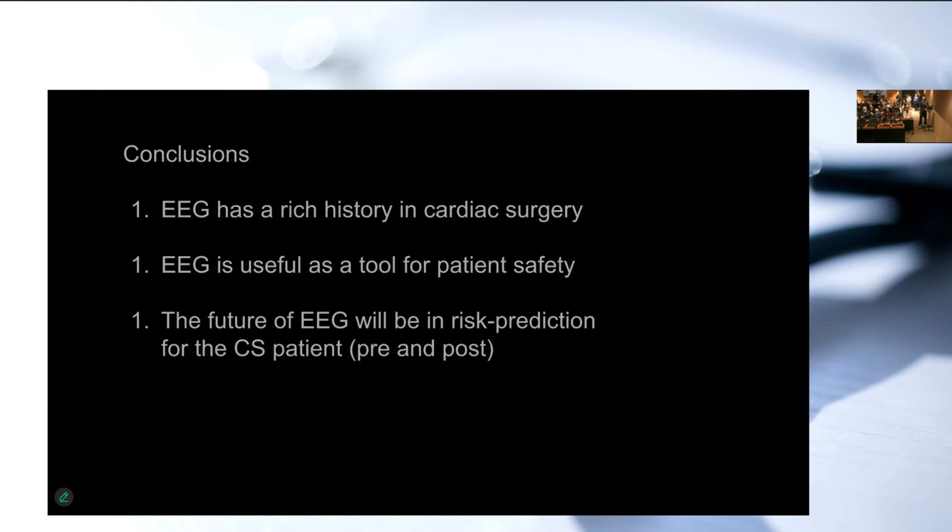And do you think that burst suppression, either as a Boolean operator on or off, is another signal that maybe in the future could help the average anesthetist recognize when anesthesia is excessively deep, as the marker maybe for something that we can do about patients' neurological symptoms? So that's question number one.